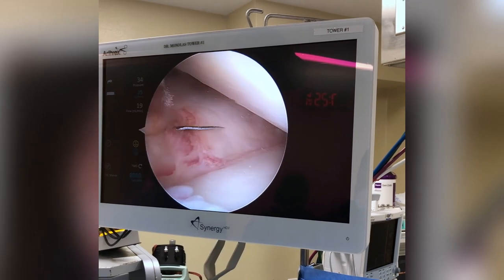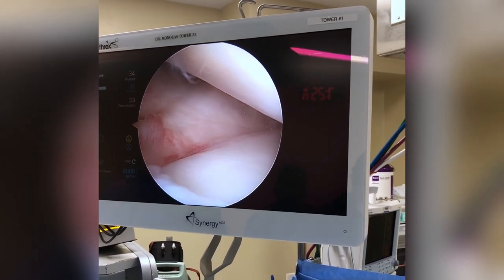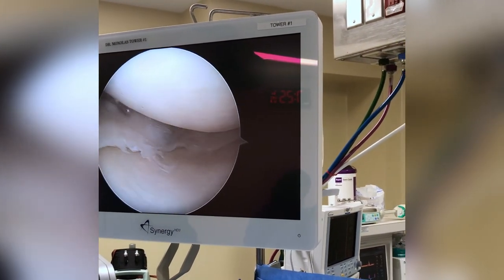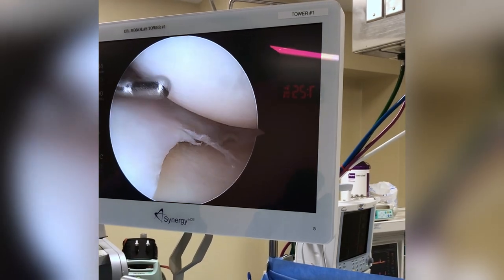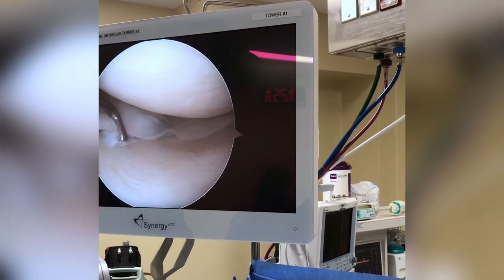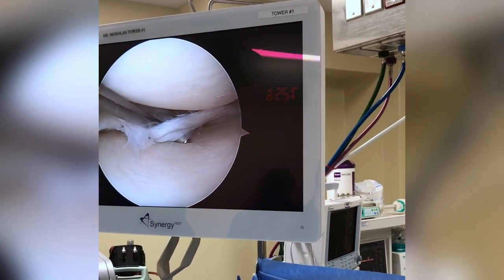Here we're making an incision so that we can get inside the knee. Here is the meniscus — this cushion here between the femur bone and the tibia bone. And here's your torn meniscus right there. That looks to be torn as well; this is unstable.